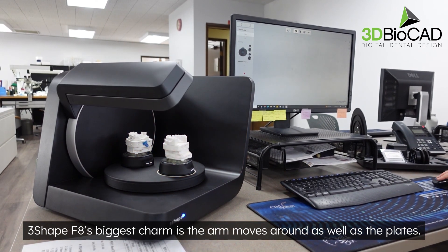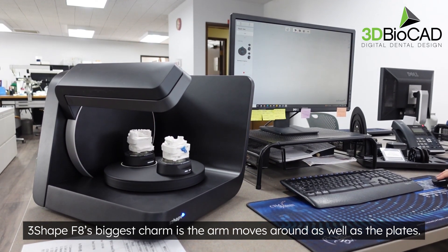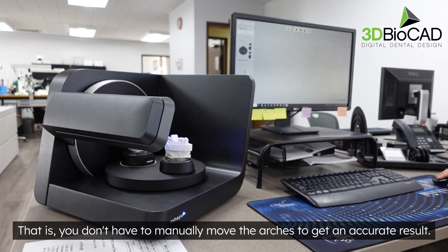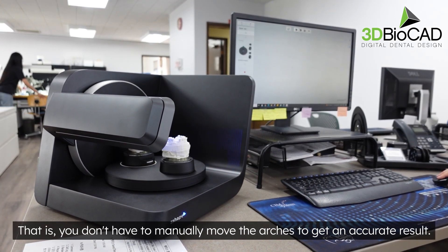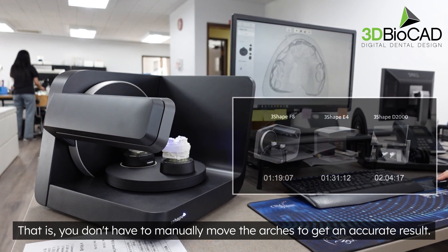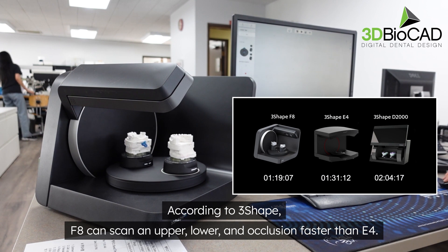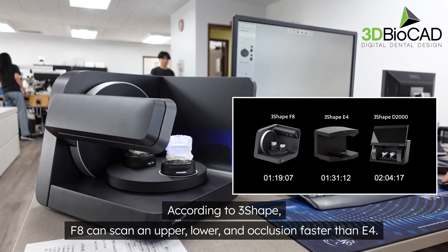The 3Shape F8's biggest advantage is that the arm moves around as well as the plates, meaning you don't have to manually move the arches to get an accurate result. According to 3Shape, the F8 can scan an upper, lower, and occlusion faster than the E4.